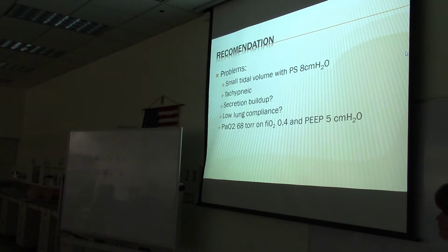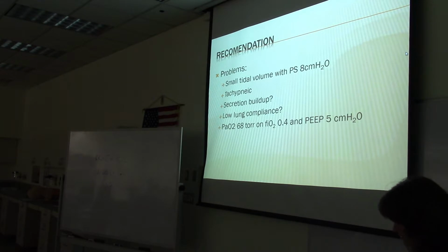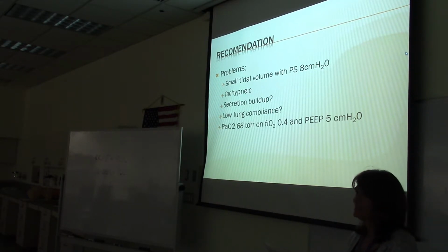A PEEP? Would we go up on the PEEP? No, FiO2. Yeah, so if we're at 60%, then it's okay. Then yes, go up on the PEEP.